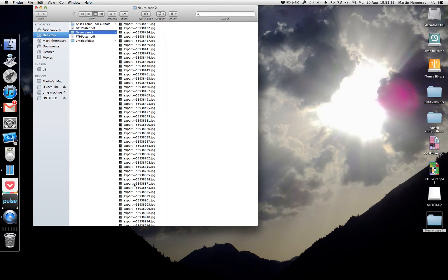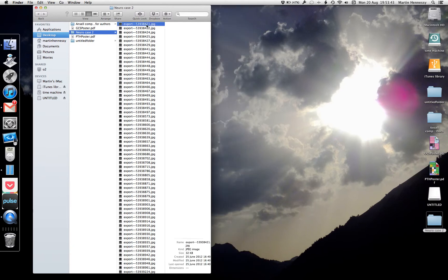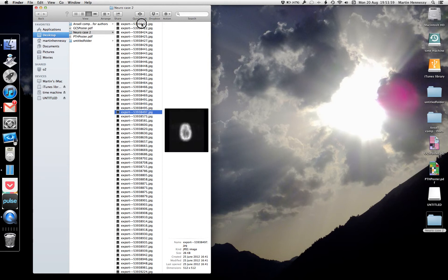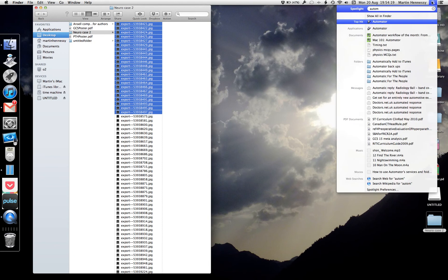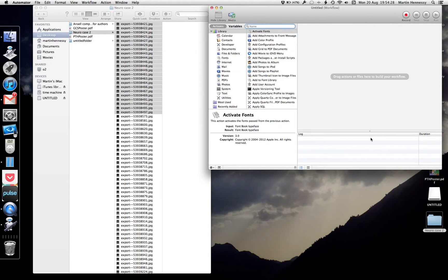Before we even go into OsiriX, for reasons that will become clear, we need to rename these JPEGs so that we can clearly identify which belong to which series. If we click on this one, this is part of the Axial T2, and having looked at this case before, I think the Axial T2 finishes at number 497. Then it goes on to diffusion weighted. So we want to rename all these files — select them all by clicking the first one and then shift-clicking the last in the list.